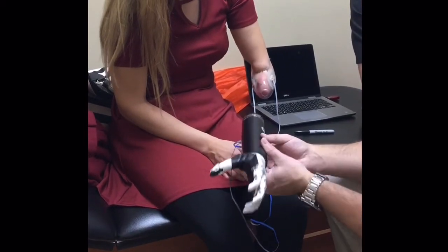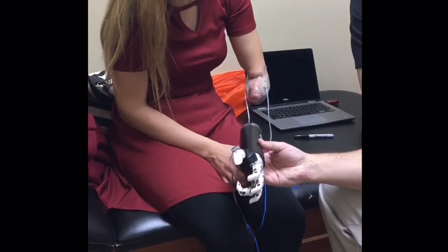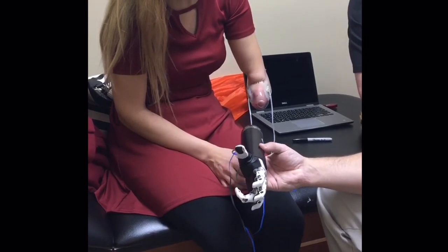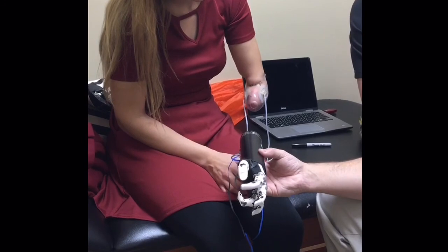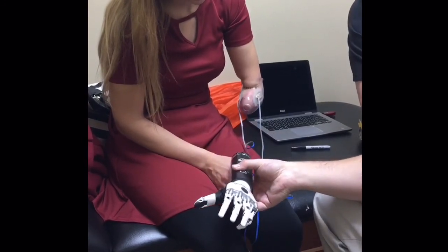Now you would bring the thumb out — bring the thumb non-opposed. Okay, go ahead. Mouse grip. And once those fingers are set, your open and close is just doing the index. So this is the mouse grip.